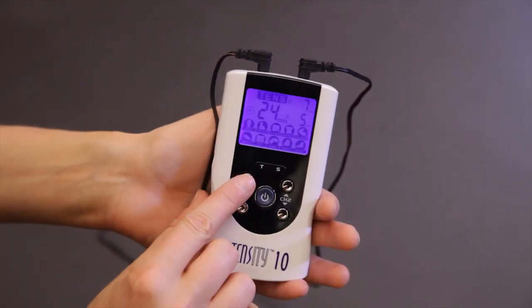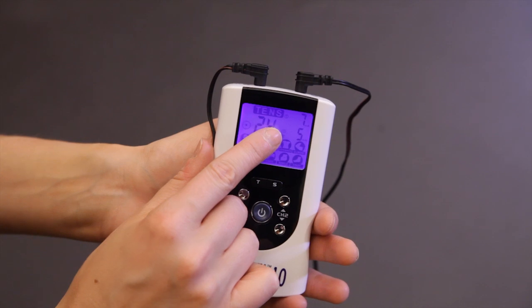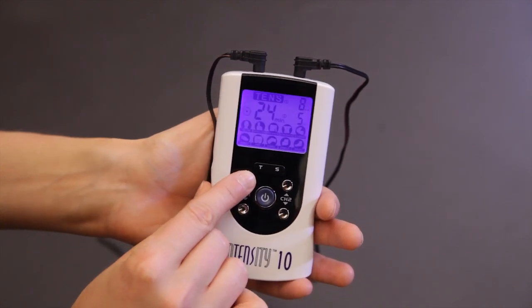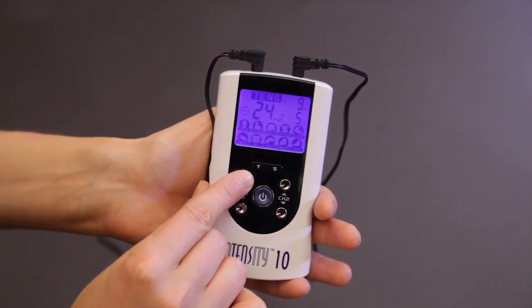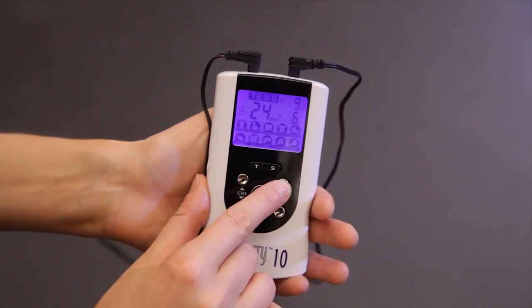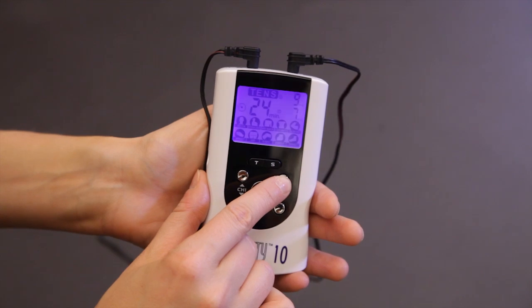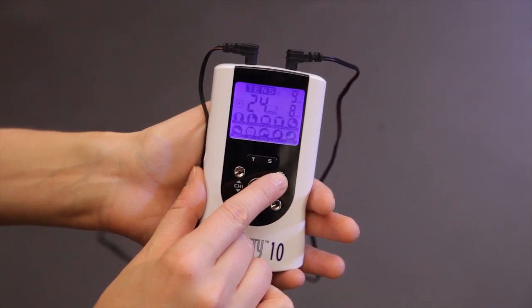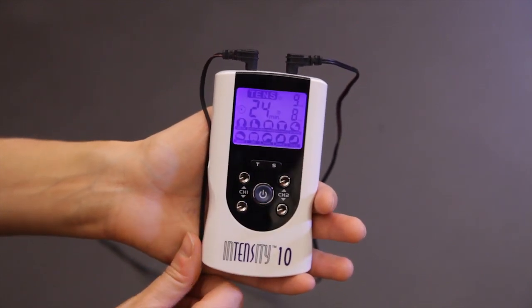The intensity control buttons are identified by the up and down arrows. Slowly increase the intensity for each channel until you've reached a desired level of stimulation. You'll experience a slight tingling sensation. To decrease the amount of stimulation, simply press the down arrow button.